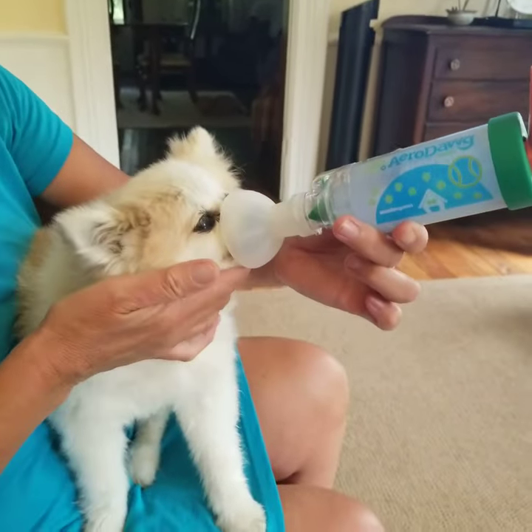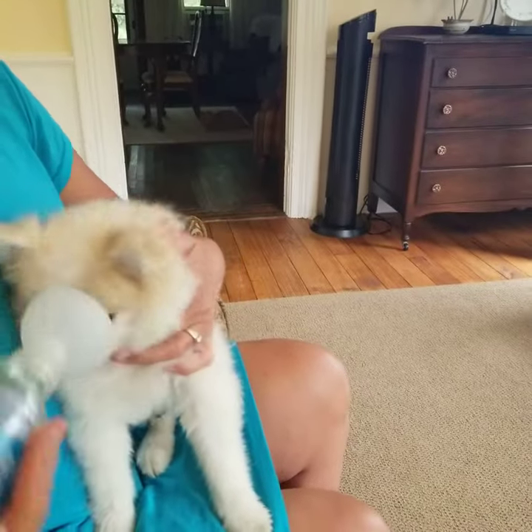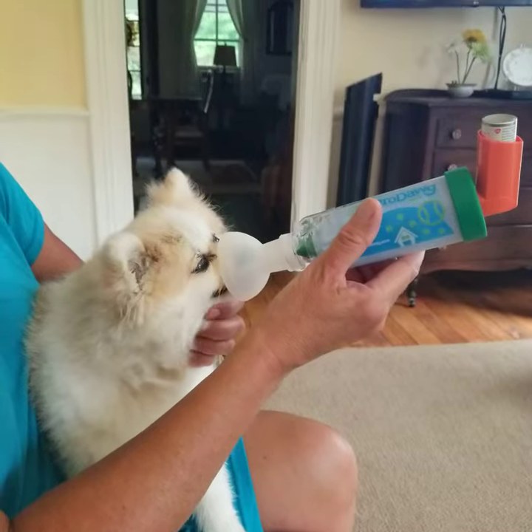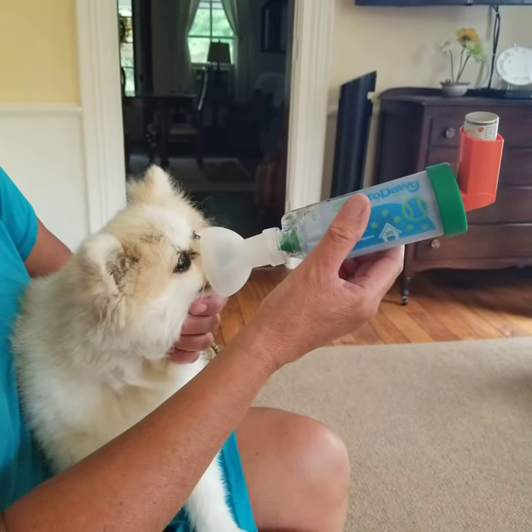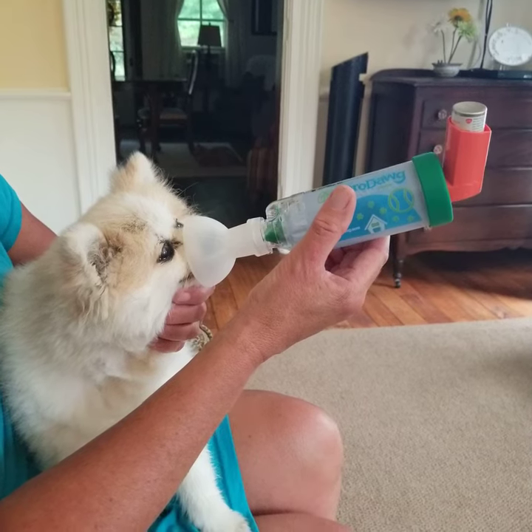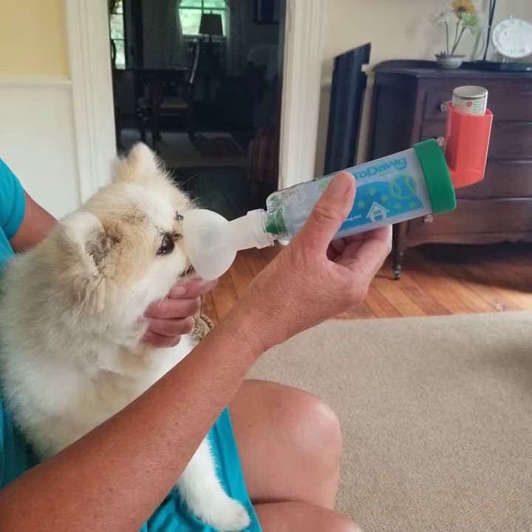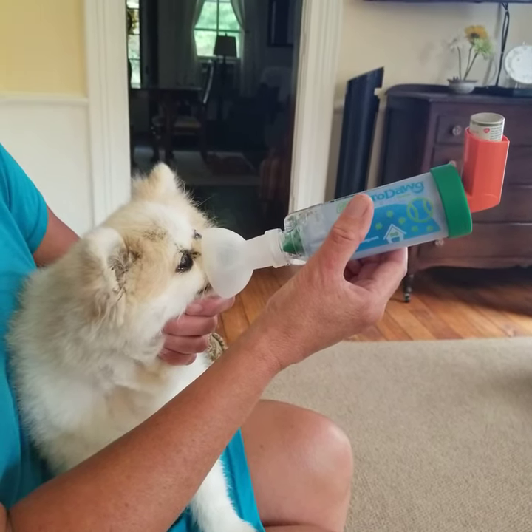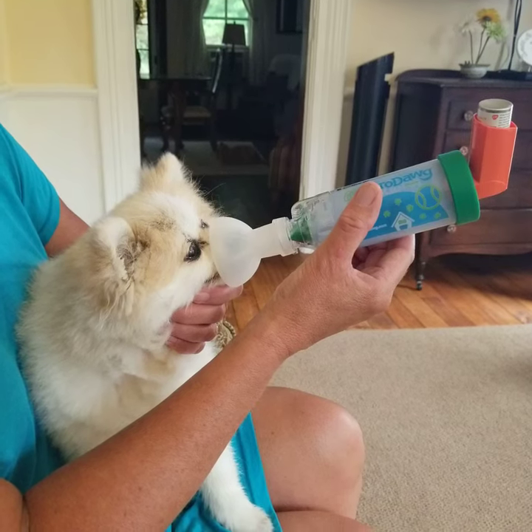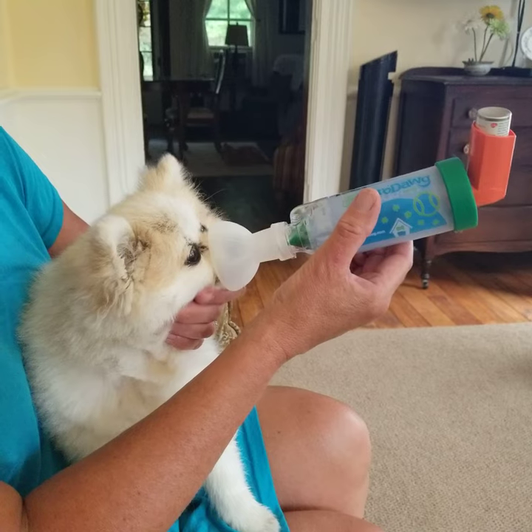Her mouth and nose are covered. I kind of lift her head up a little bit so that it opens the airway, and she'll balk — she doesn't like it. So I kind of hold her like this. You should see that flapper moving slightly, sometimes a little more, depending on how deep her breath is. I like to see that flap about 10 times. Stroke her chin a little bit — it kind of relaxes her.